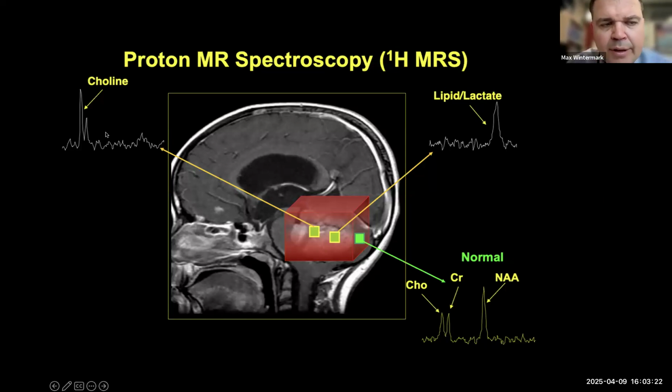And when you deal with a tumor, again, you use your creatine peak as the reference. So typically here you can see that the NAA peak has kind of vanished, and that tells you that the neurons have been affected, have been damaged, and therefore their peak is going down, while the choline peak is increasing. And the choline is a marker of glial membrane. So when the choline peak is increased, it tells you that you have an increased turnover of membrane, which you typically observe with processes like brain tumor.